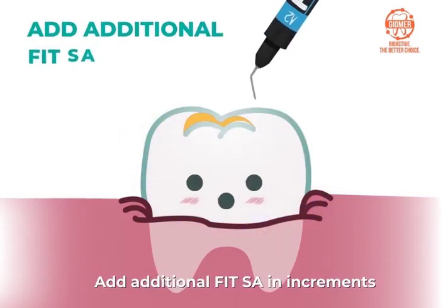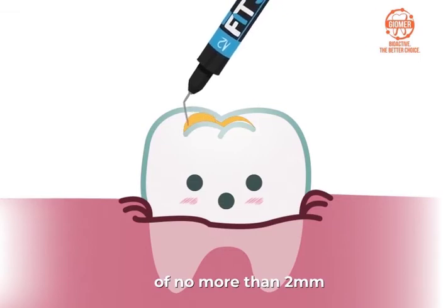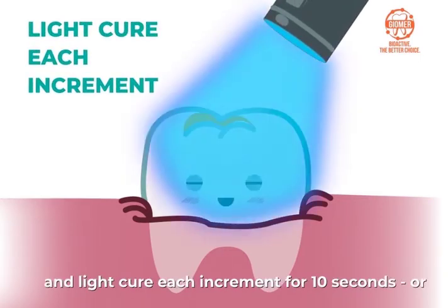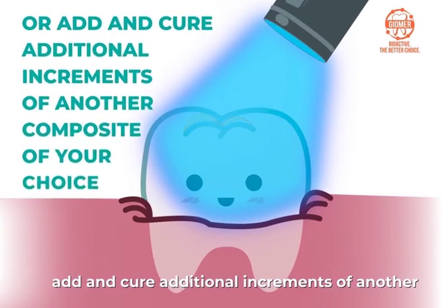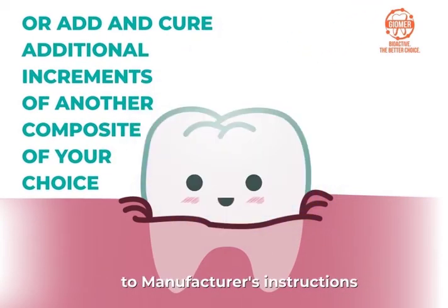Add additional FitSA in increments of no more than 2 millimeters and light cure each increment for 10 seconds, or add and cure additional increments of another composite of your choice according to manufacturer's instructions.